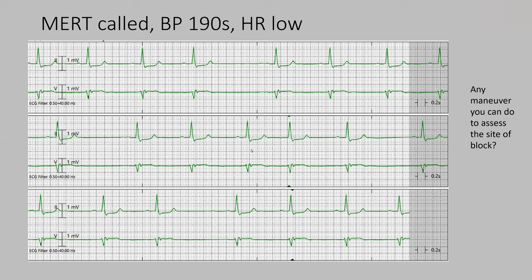No, just let's think a little simple. This is in the middle of the night. Patient did not pass out or get dizzy, right? Okay, fine. If we think simple, one possibility is vagal, but if it were vagal, we expect the blood pressure to drop a little bit also. Correct. It did not, but you can have isolated cardioinhibitory.